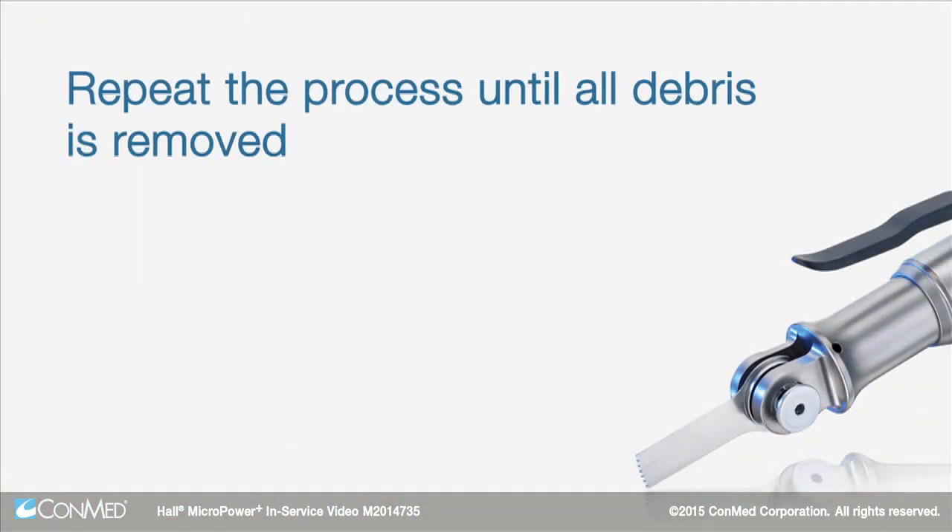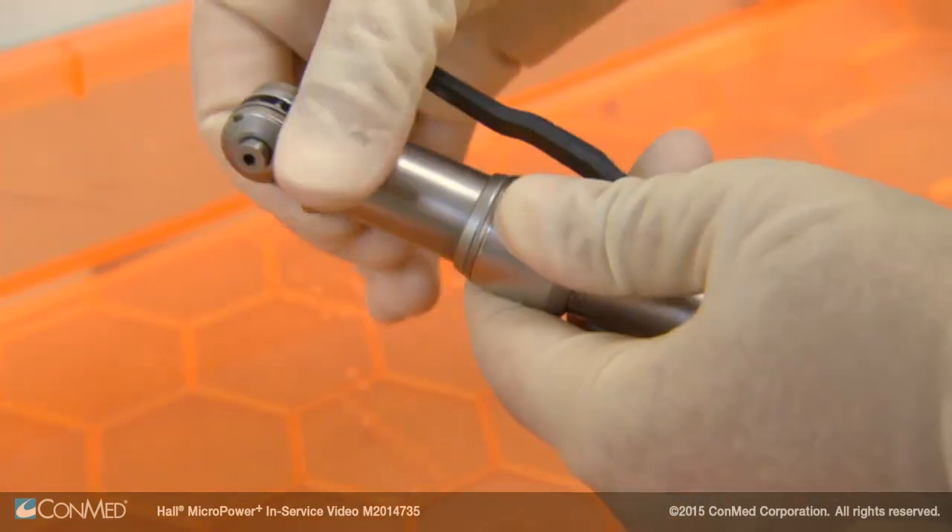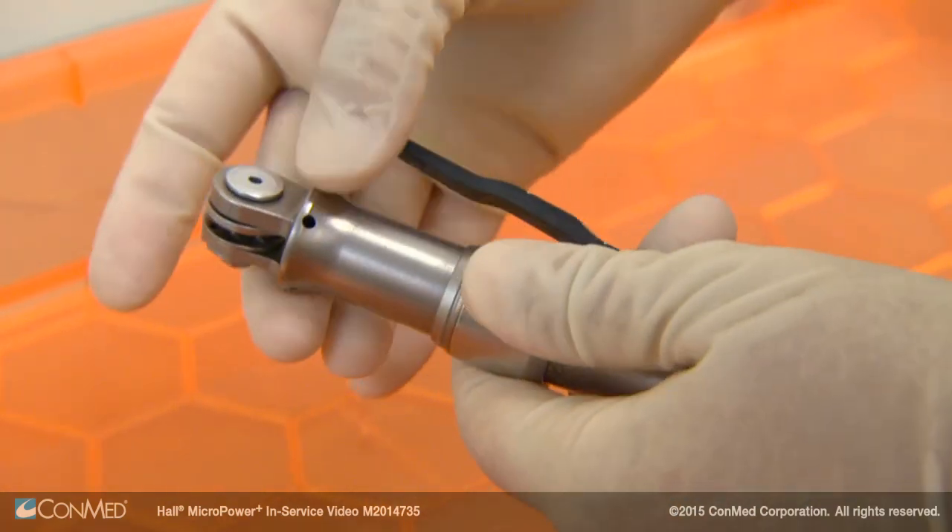Repeat the process until all debris is removed. Manipulate all moving parts of the handpiece and attachments to ensure all debris is removed.